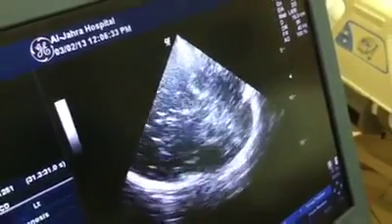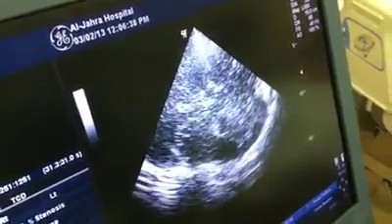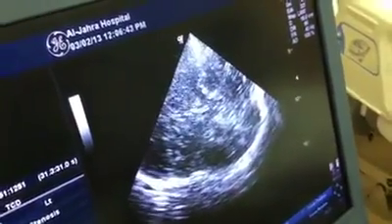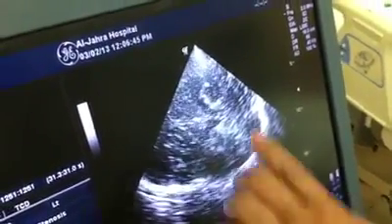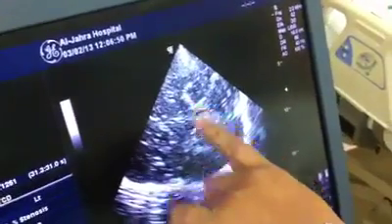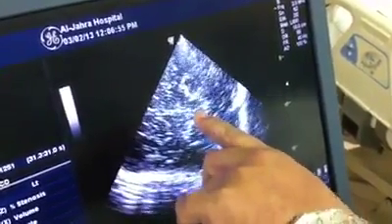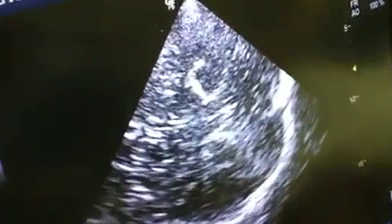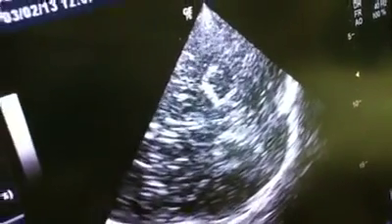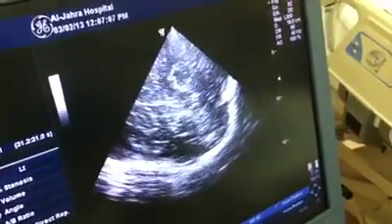All right, so ultrasound TCD is much easier. How do you do it? This is one of those peanut signs, or bat wing sign, or bat sign, or somebody would say some other sign. Basically this is the brainstem, and this is one of those peanuts you can see. Inside the brainstem in the middle is the midline. Some experts can tell you from TCD how much midline shift has occurred in post-head injury patients.